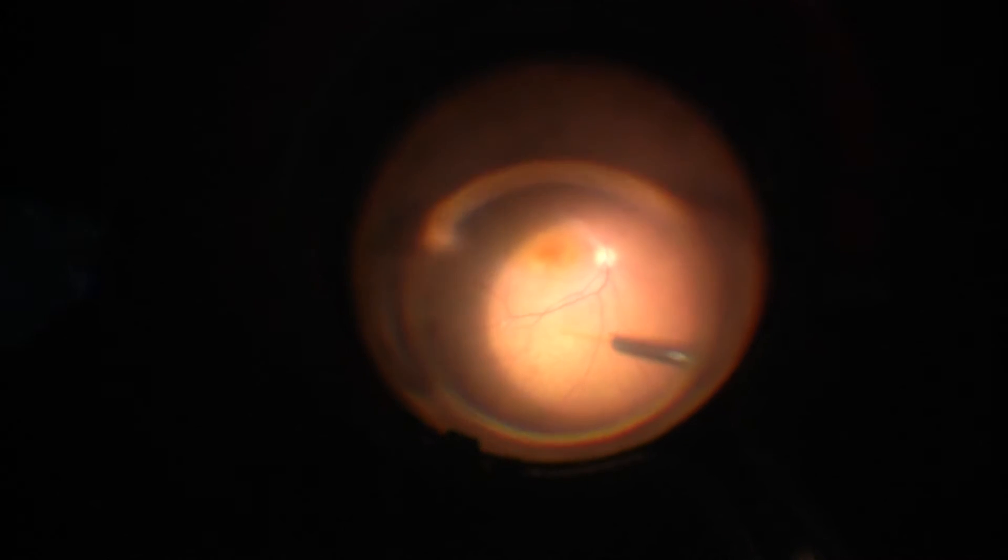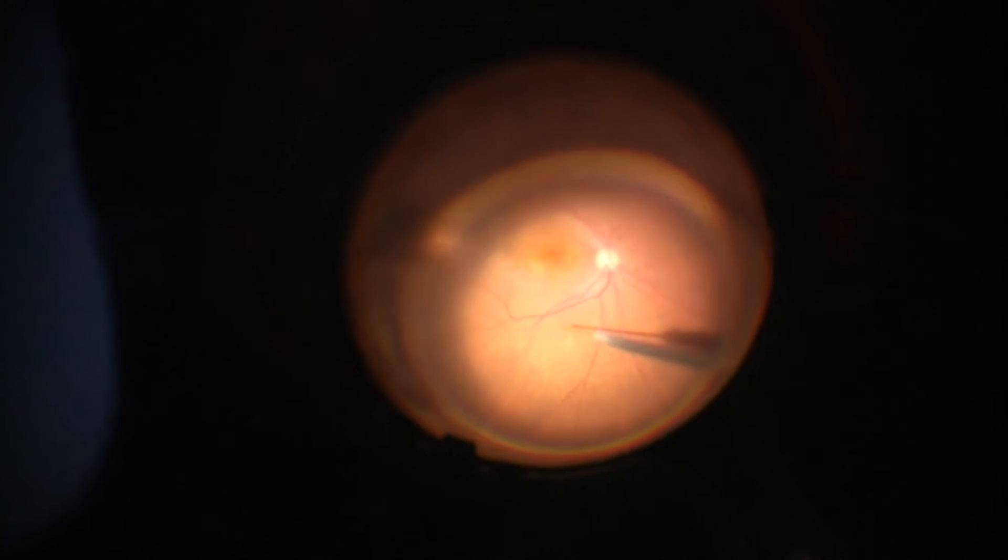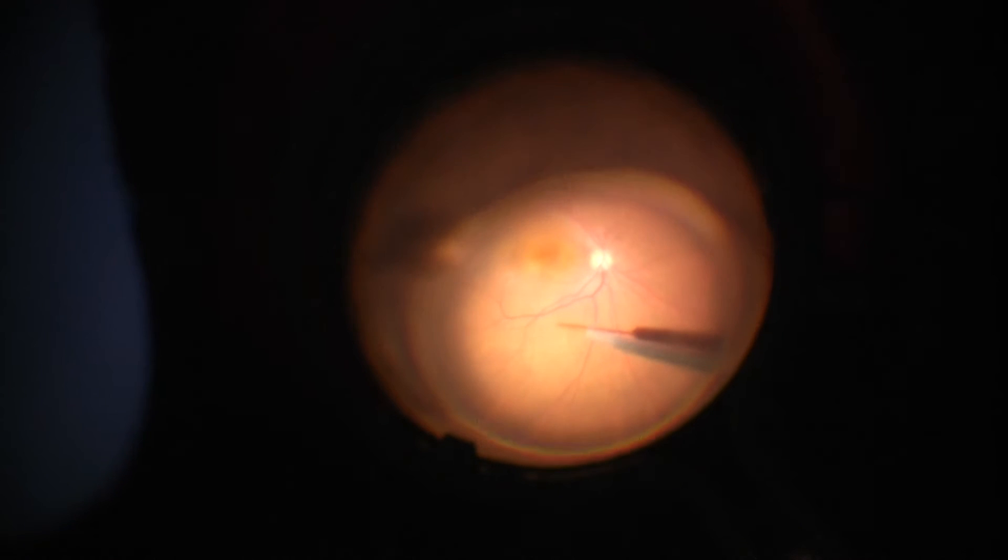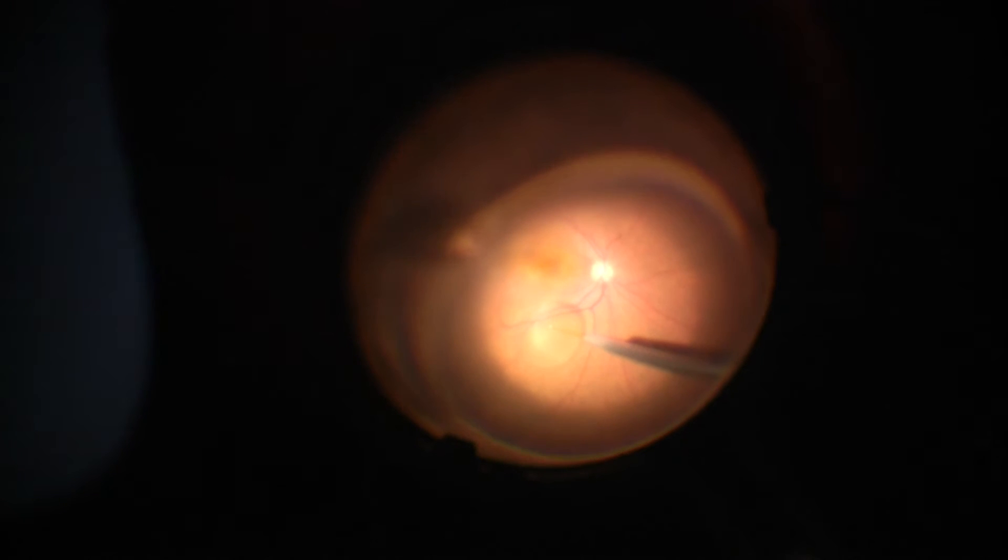This microcalibrated injection system allows surgeon-controlled delivery, where you can see we're delivering outside of the macula approximately 250 microliters of approximately 3 billion gene copies of this AAV8 vector encoding for a transgene that produces a protein product very similar to ranibizumab.